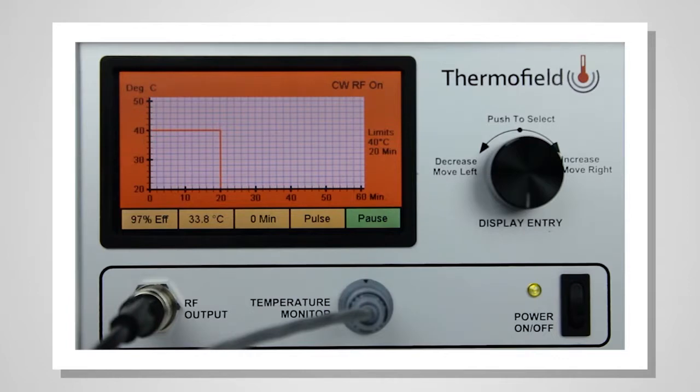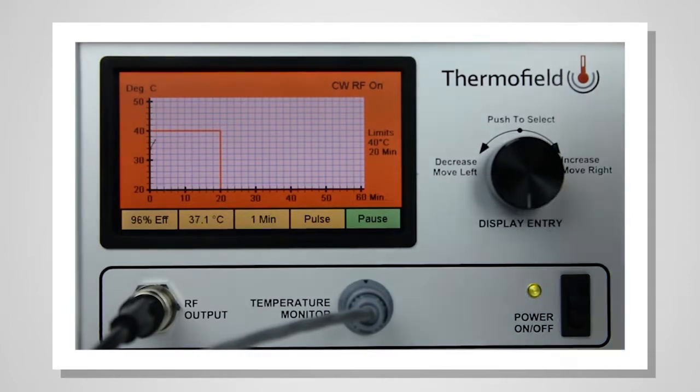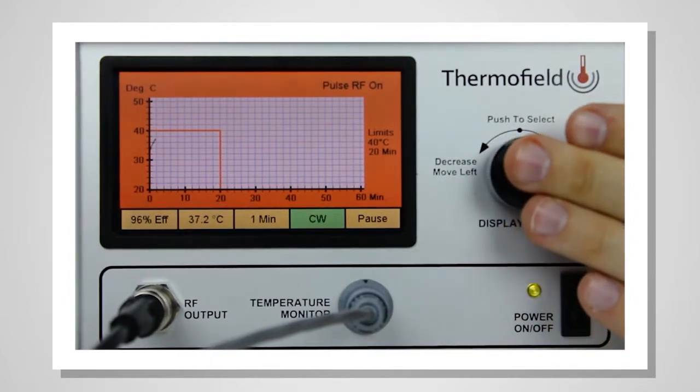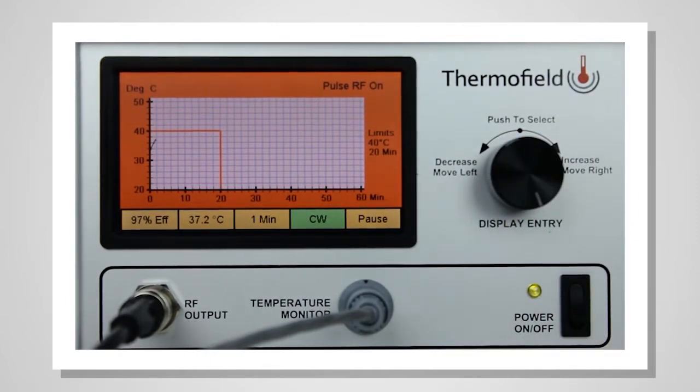At any time during the treatment, you can switch from CW to PULSE mode. Turn the knob until PULSE is highlighted. Pushing the knob will toggle between CW and PULSE.